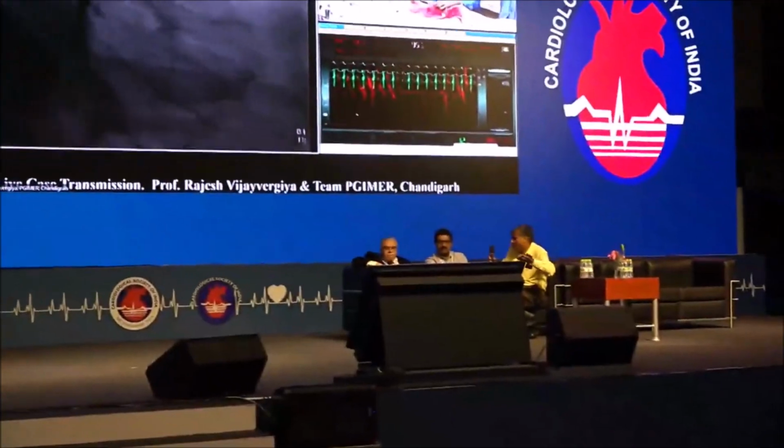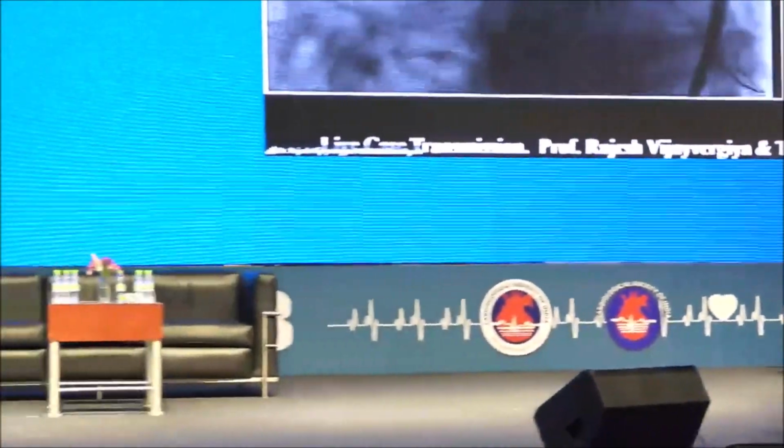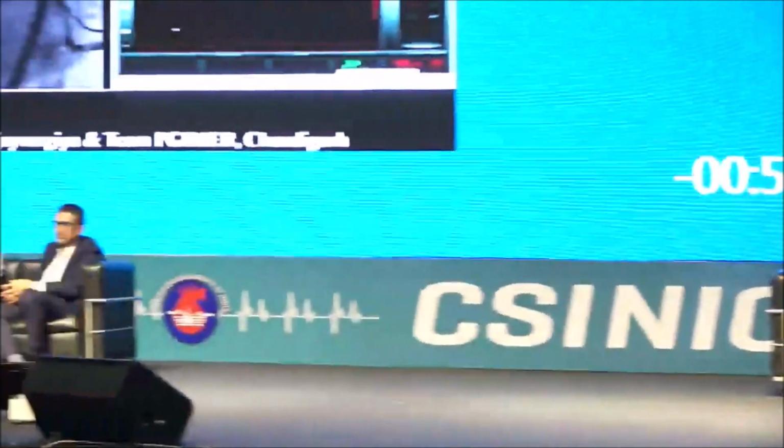I think that would be one strategy, but DK crush is good. No, you're correct. If you look at the data though, if you're going to do a 2-stent strategy in this scenario, I would argue that DK crush is probably the best option. Provisional, we could argue provisional, but this is a large circumflex, so I don't think so. But anyway, in the interest of time, I think we're now way over. I think we'll end the session.